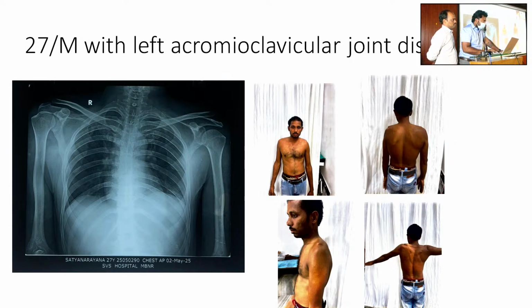Is it vertical or horizontal instability? On X-ray, sir, a pure dislocation, not a fracture of the lateral end of the clavicle. X-ray should have been taken of the shoulder. That's the regular X-ray even for a shoulder injury. It is very essential, otherwise it is going out of focus. Stress images with wrist weights. You want to see the clavicle only. That's not a properly taken clavicle view.